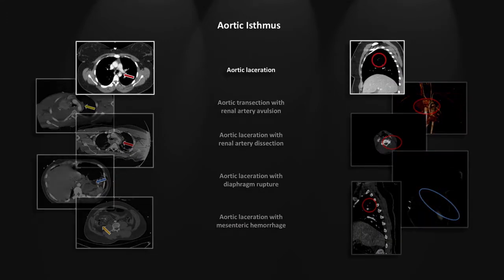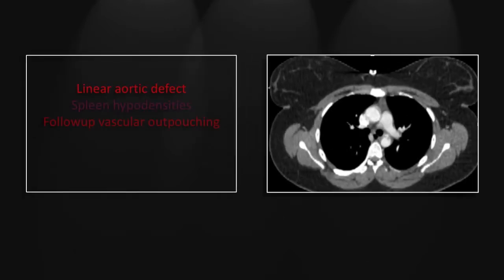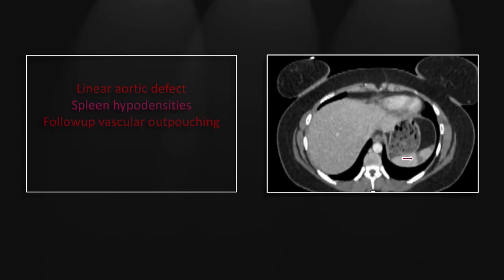Our first case is of an aortic laceration at the aortic isthmus. This is the most common site for aortic lacerations. You see here an irregular defect in the anterior aspect of the descending thoracic aorta at its junction with the posterior aortic arch. There is little or no mediastinal fluid. The presence of mediastinal fluid can be a useful indicator of a vascular injury, but its absence cannot be used to exclude a vascular injury. We have additional diagnostic help in the spleen, where you see wedge-shaped, well-circumscribed peripheral hypodensities consistent with thromboembolic phenomena, suggesting the presence of a proximal vessel injury.